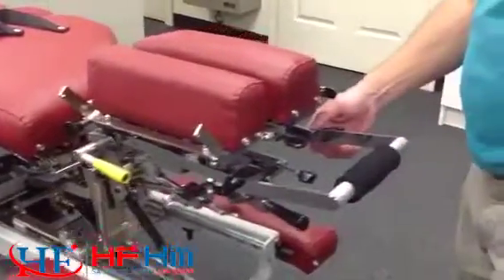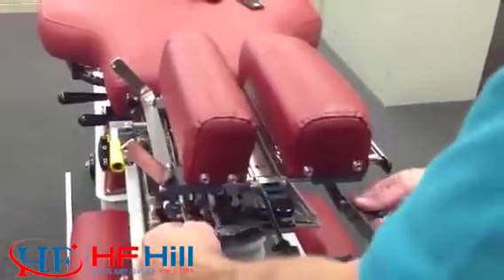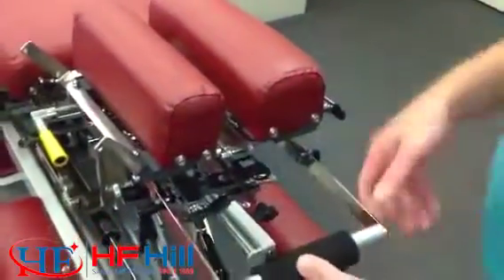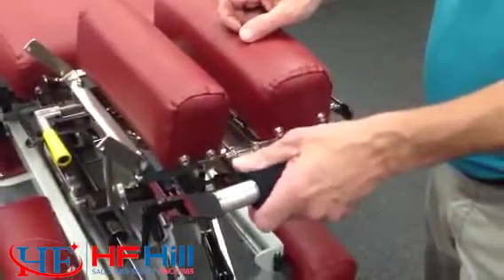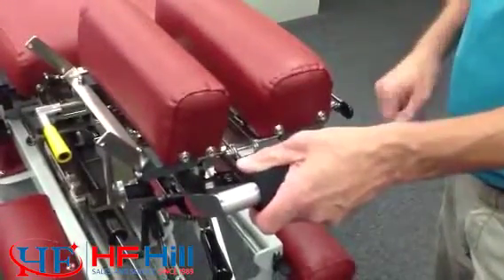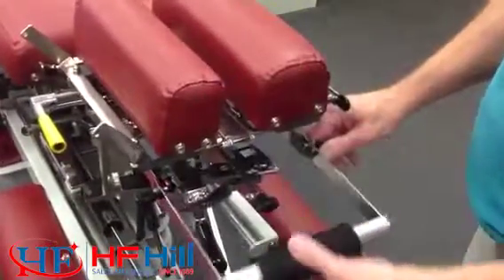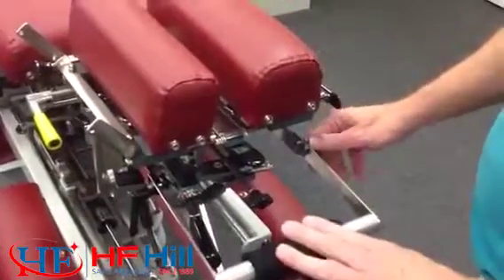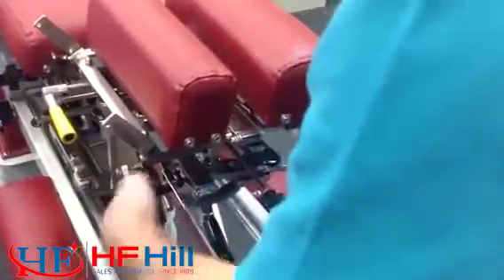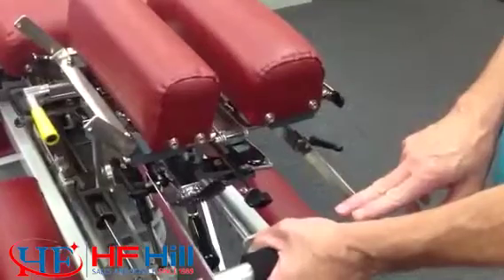Alright, as we move to the front here, we have 2 black knobs, one on either side, and they are actually ratchet knobs, and they allow some adjustment here on your handle or your handlebar, as the doctor would keep one hand on this to guide the motion of the headpiece. So when you get it at the position you like it, I'm going to leave it down again. We tighten this knob, righty-tighty, and we tighten this knob, righty-tighty. All right? So our knob is in the locked position.